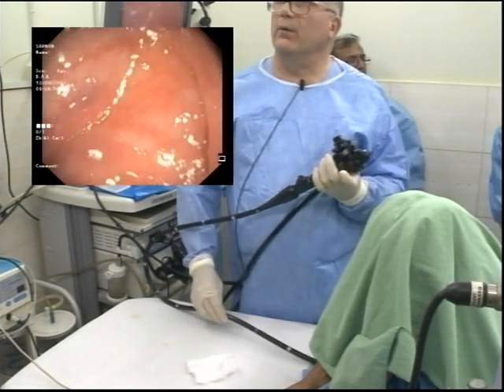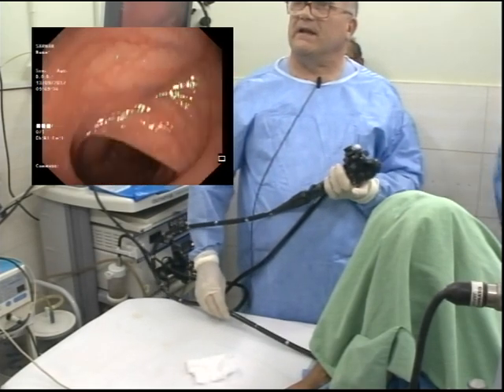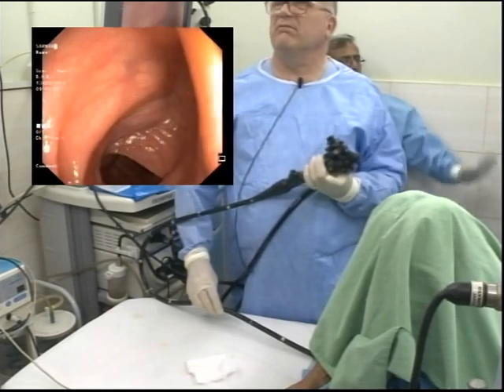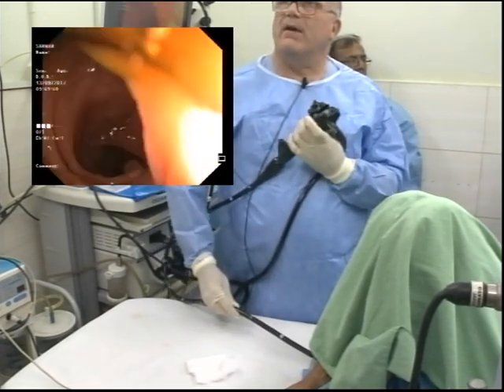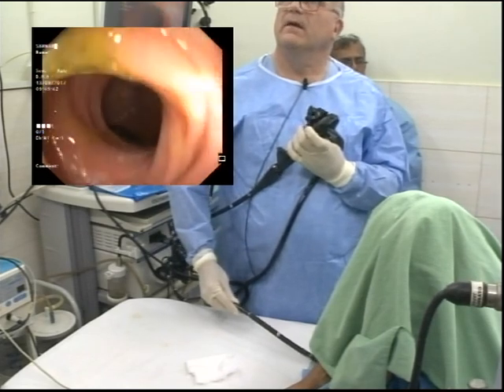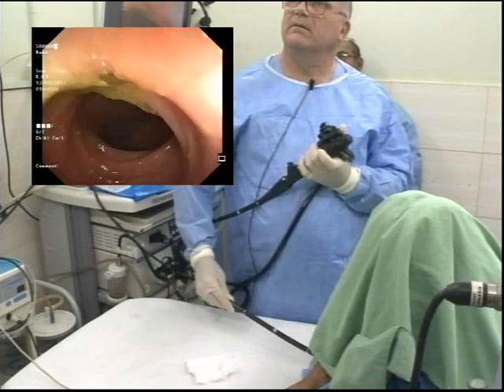Don't over-diagnose. Somebody could turn around and say, that's a diverticulum. Okay, maybe a diverticulum. But what's the point in mentioning it? It's got no bearing on what we're trying to exclude here, and it's of absolute clinical insignificance.